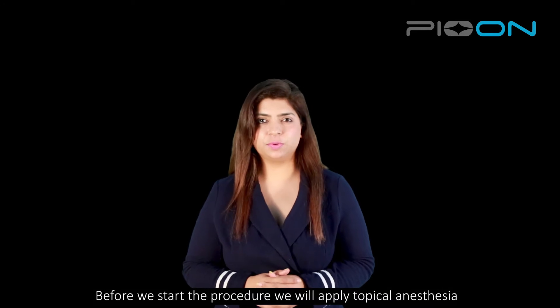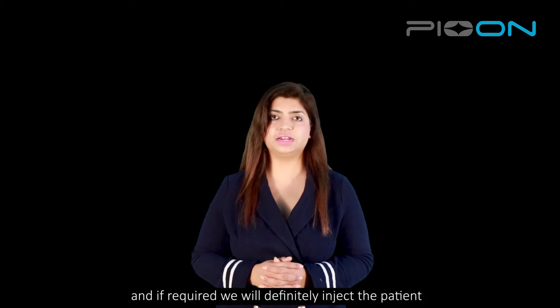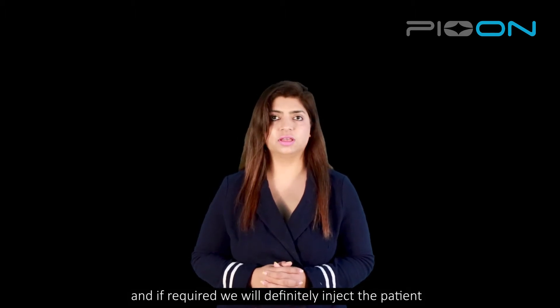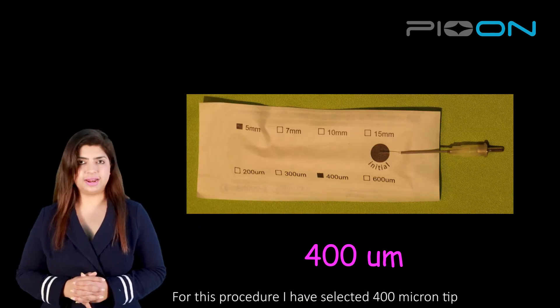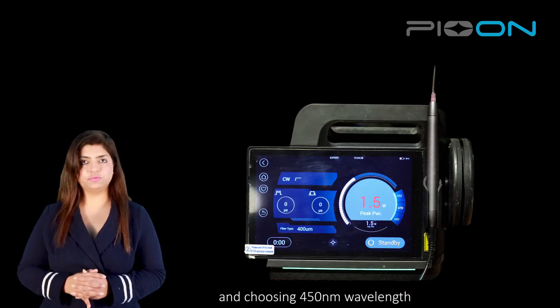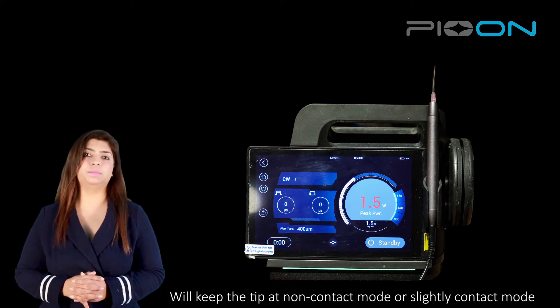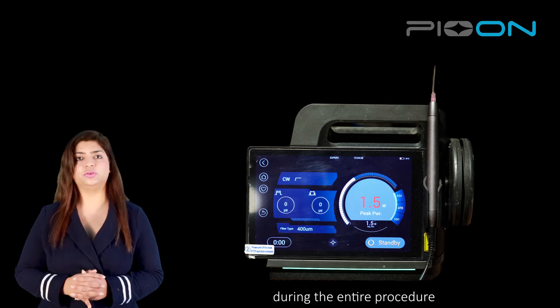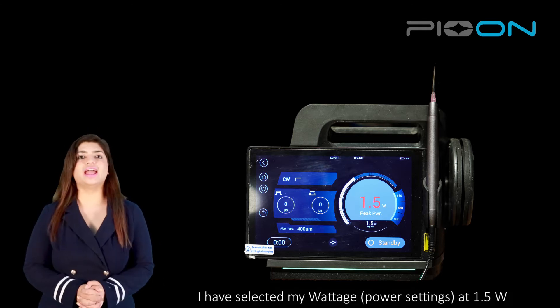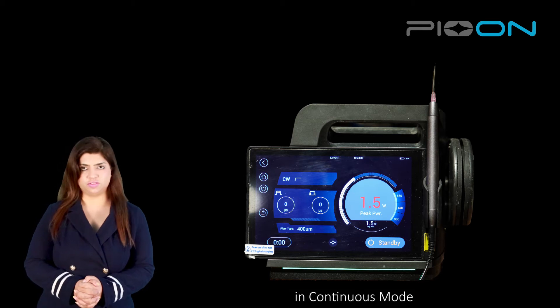Before we start with the procedure, we will apply a topical anesthesia to the patient and, if required, we are definitely going to inject the patient. For this procedure, I have selected a 400 micron tip initiated with 450 wavelength, making sure that I keep the tip in a non-contact mode or a slightly contact mode during the entire procedure. I have selected my wattage to be 1.5 in a continuous mode.